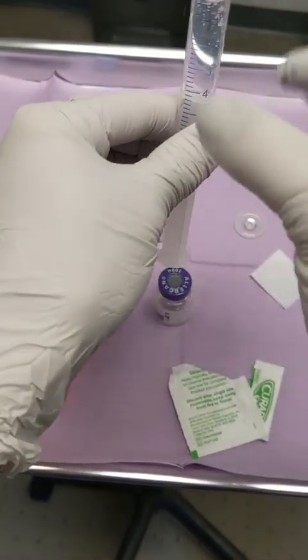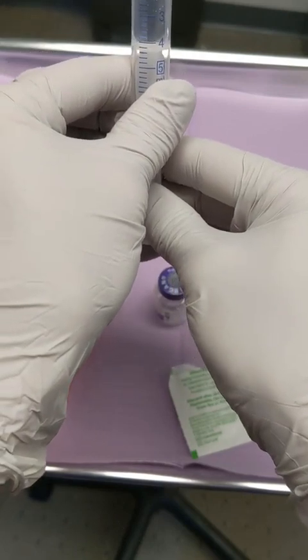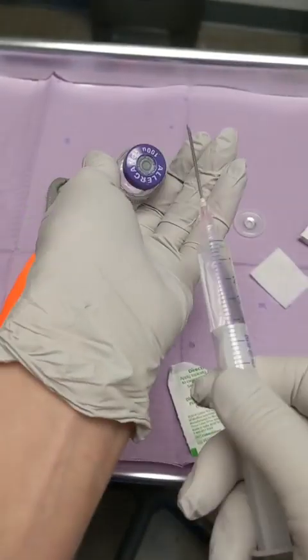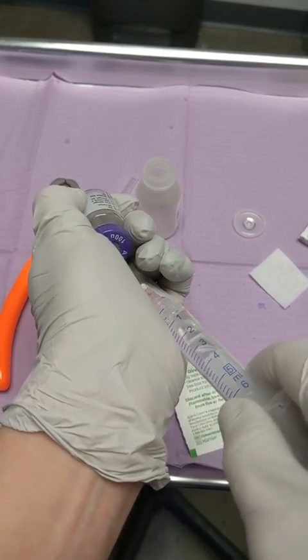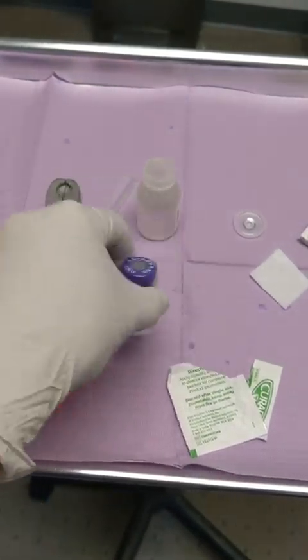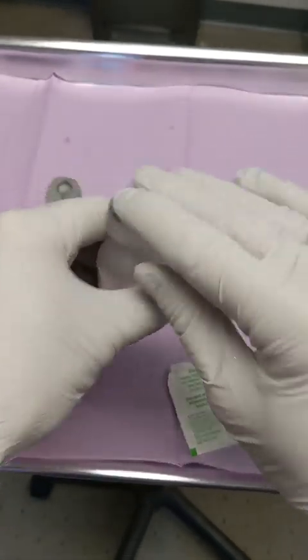Here I draw up 4 cc, just remove some air bubbles, and then I will add that to the Botox bottle. Here we go. Control the plunger so there are no bubbles, and roll the bottle a little bit to make sure I get all the powder of neurotoxin.